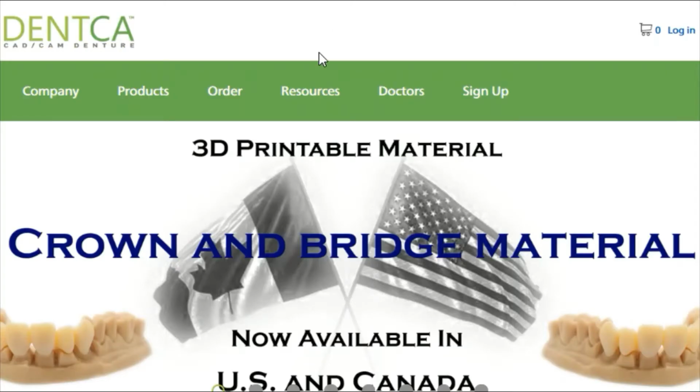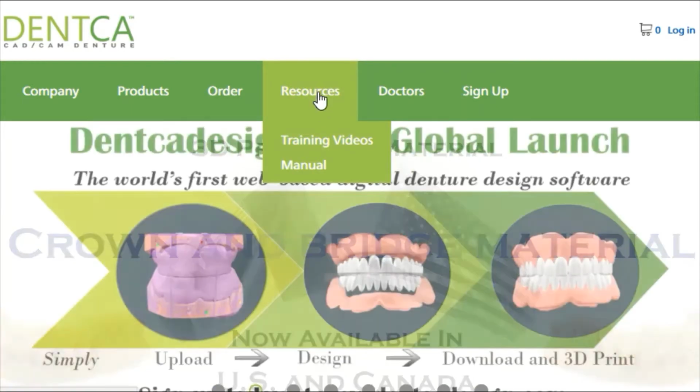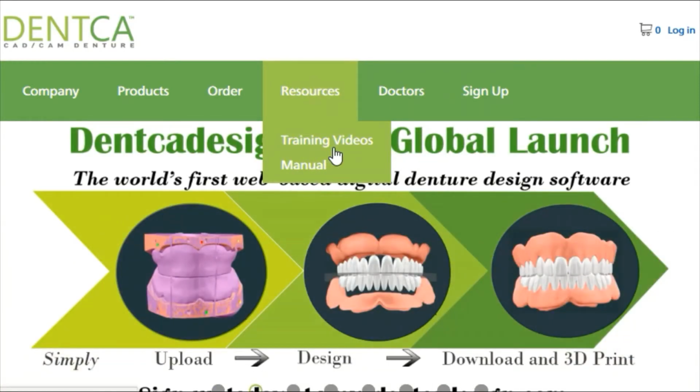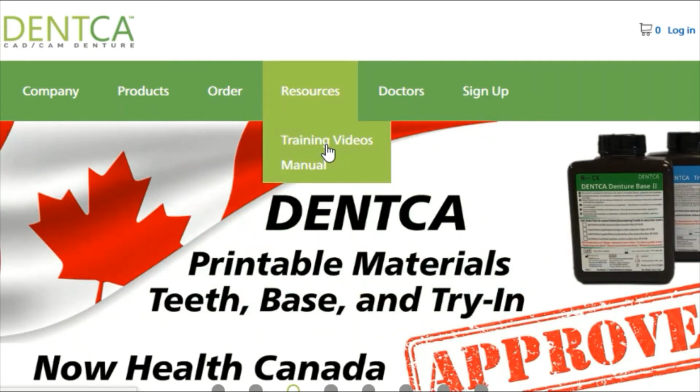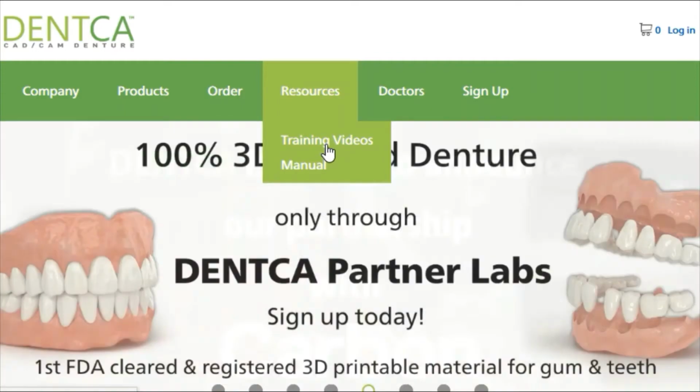DENTCA has several pre-recorded manufacturer videos on the dentca.com website under resources and then training videos. If you click on this section, you will be able to find videos for scanning, printing, post-processing, polishing, and other manufacture steps. For your convenience, I'm going to include these videos in the current video that you're watching, but if you want to find them individually for review, you can always visit the DENTCA website.